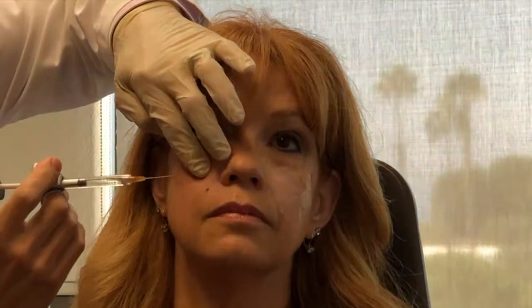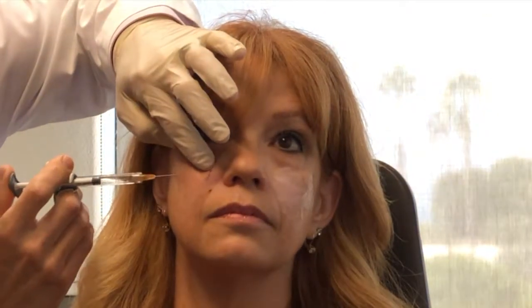You can see how this contour is now coming up and we can move towards the medial space. One of the things I am also doing is using my opposite finger to occlude the critical arteries that we can inject into in the event that we do have intravascular injection. I am starting to see this contour filling in and the curve coming back. There is a subtle improvement in the nasolabial fold, and yet we still need to move medial in this area, so we are going to come in from the nasolabial incision.